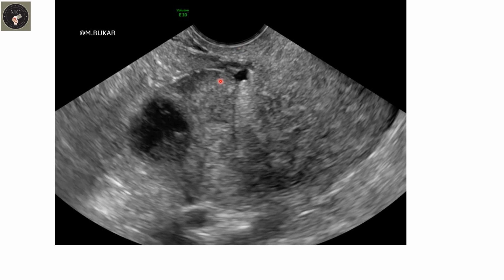In this short video, I will demonstrate both positive and negative sliding sign. The negative sliding sign is, however, false negative. This is the bowel, briefly in the peritoneal cavity, the ovary, and the uterus.